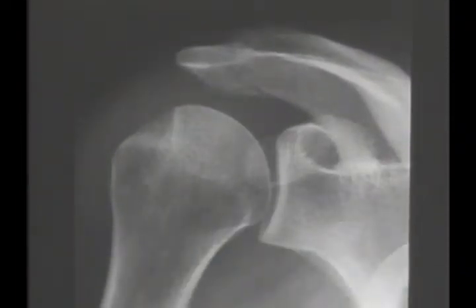In summary, variations in the acromio-humeral window according to longitudinal angles are as follows. At left, no angulation. In the center, normal angle of 10 degrees toward the feet. And at the right, too much angulation.